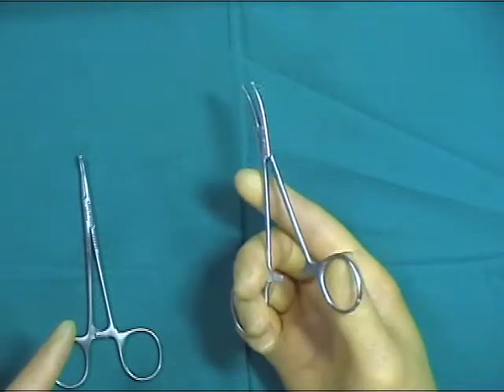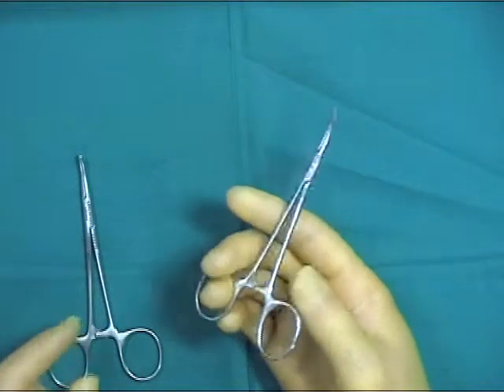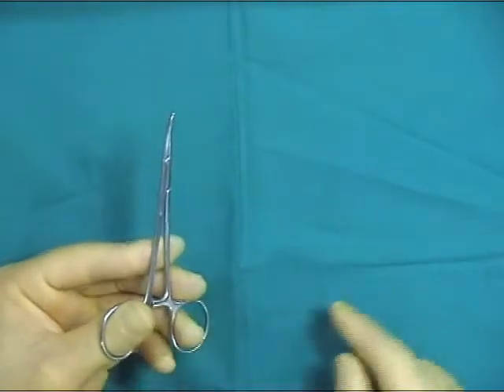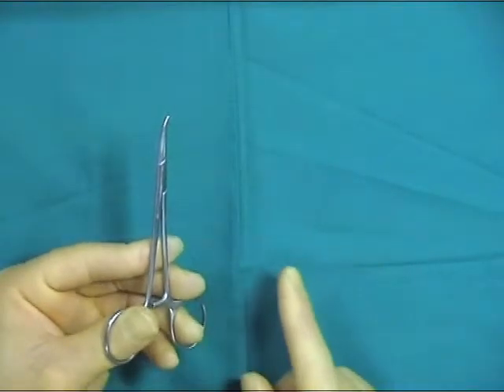All these hemostats are designed for right-handed individuals, and in a similar fashion to scissors, it is quite difficult when held in the left hand to unlock the hemostats as one intuitively pushes away with the thumb.